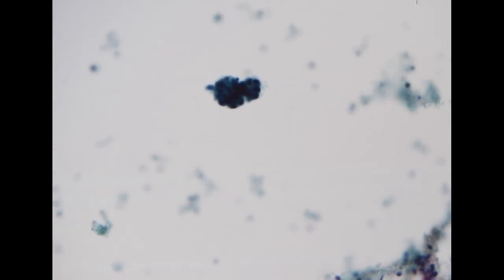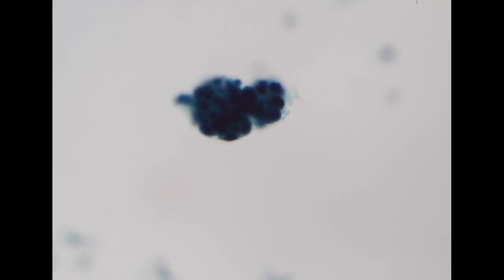So this is positive for adenocarcinoma. We will just need to wait for the biopsy to confirm that it is prostatic origin, but this looks like prostatic origin.